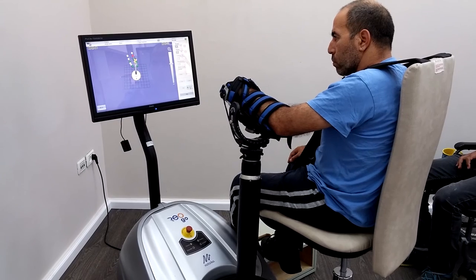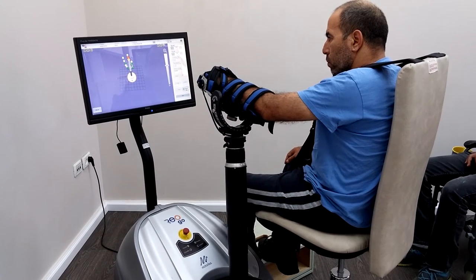The REOGO will primarily work on improving a patient's proximal movement at the shoulder and elbow, but will also allow practice of grip and release distally.